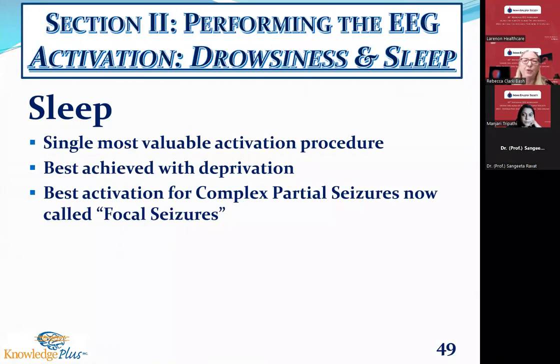Now, the last part of my lecture has to do with sleep. I'm not going to go through every sleep pattern, but I want to talk about them so that you understand how deep my patient has to get into sleep to be an advantage to just ruling out or determining a seizure type, seizure classification, and secondarily treatment. So in this example, it says here, it's best achieved with deprivation. I can't stress that enough.